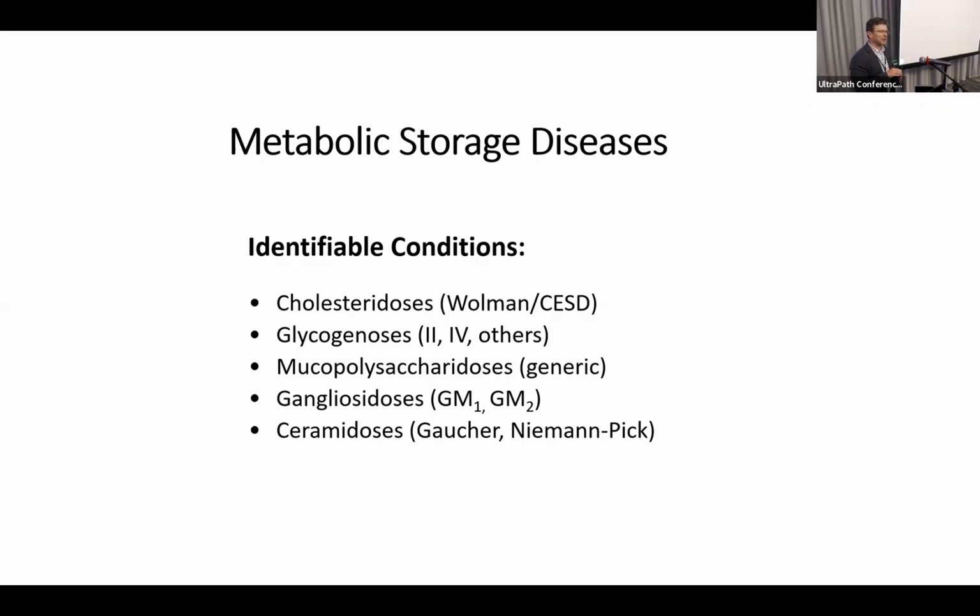We don't do it so much anymore because we don't have time, but a lot of these tumor diagnostics, we used to have a list of all the different tumors that had specific EM findings, and regardless of whether they needed EM for diagnostics or not, we would have them put a small piece of tumor in glutaraldehyde. Then we would work that up ourselves as part of our departmental QA program, comparing what we thought it was based on the EM with the final diagnosis. And 99.9% of the time it all matched up.